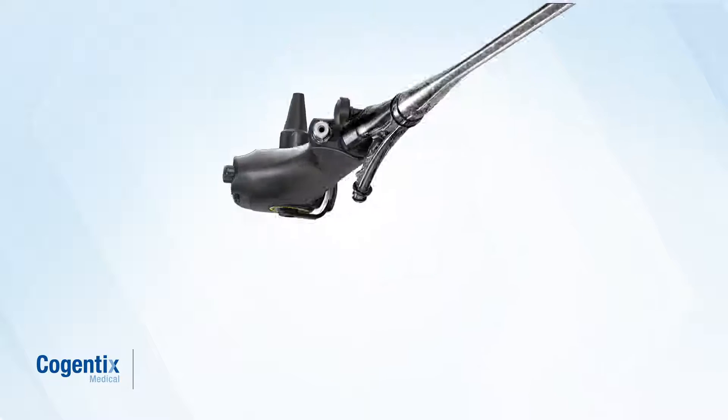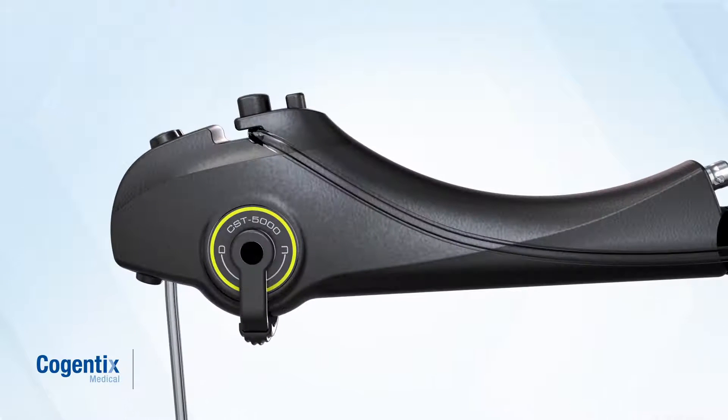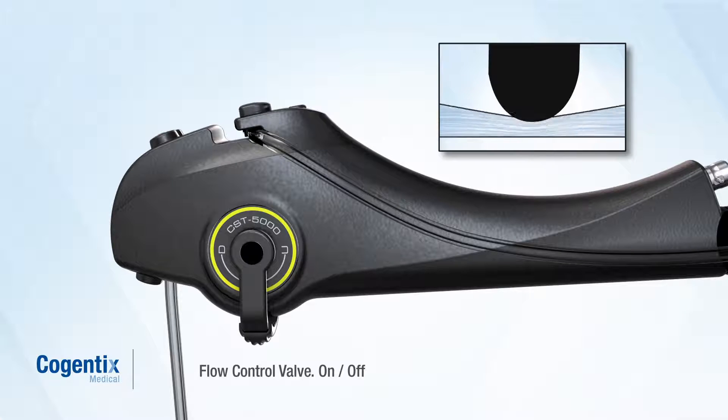A unique flow control valve integrated into the handle of the cystoscope allows for easy, one-touch control of irrigation into the bladder.